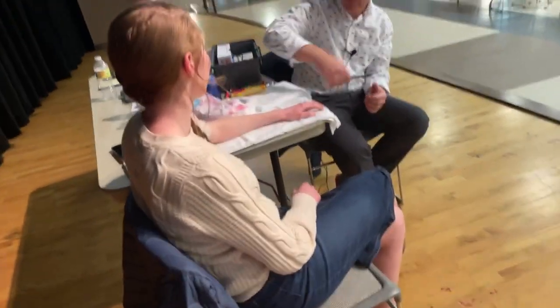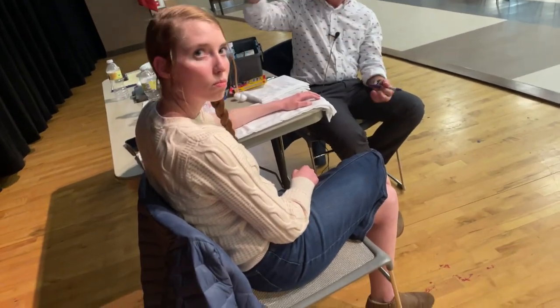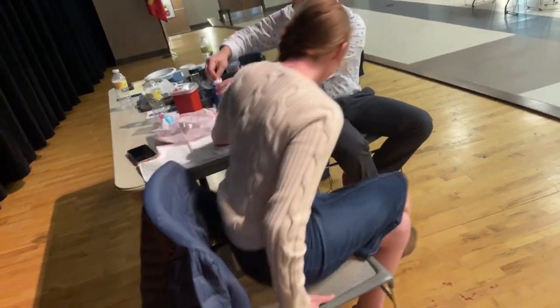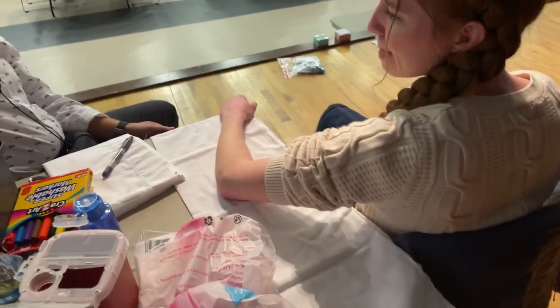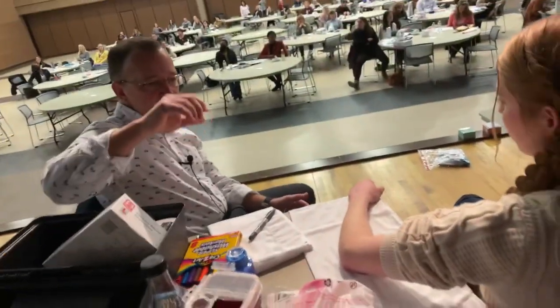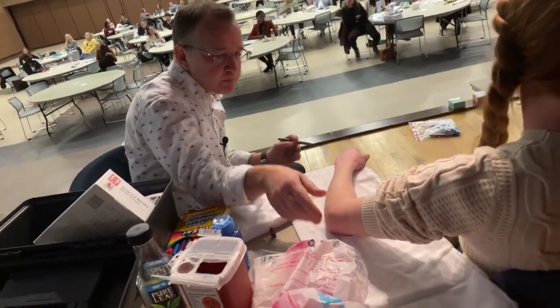I've got my supplies out. I'm going to clean her skin with a little alcohol prep in just a minute. I've got a sharps container to dispose of the needles, cotton balls for hemostasis, a supply of needles in different lengths and different gauges, and I've got gloves that I'll put on to provide a good treatment.